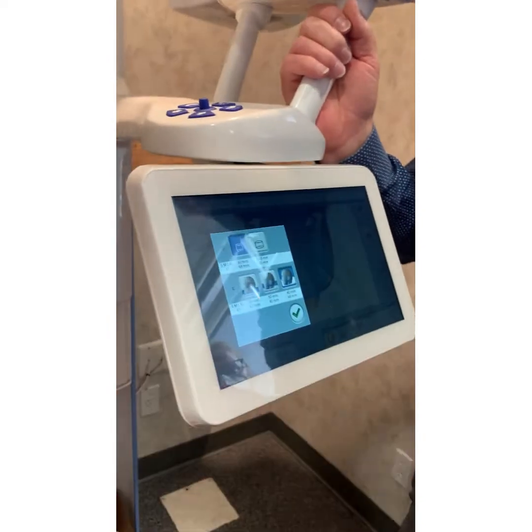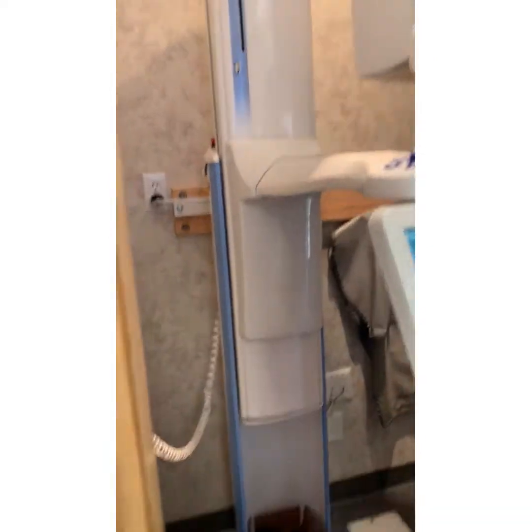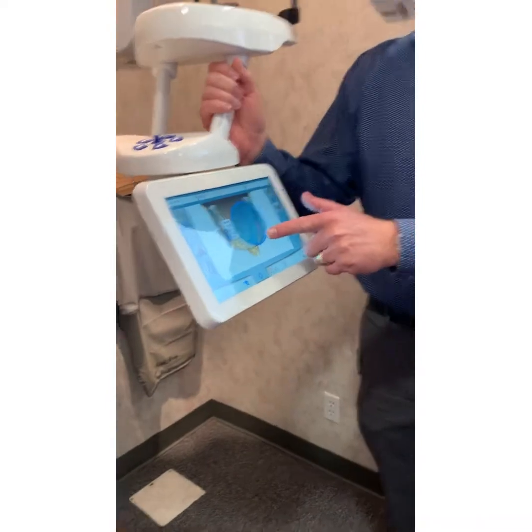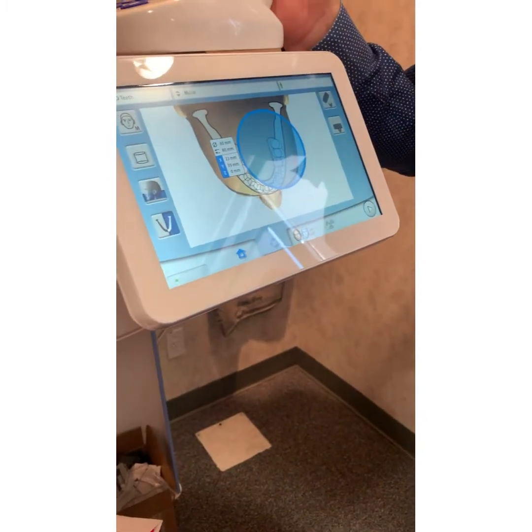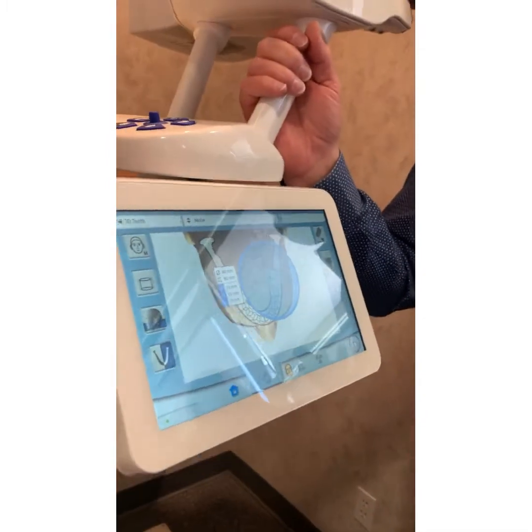I think it's easier for you guys if you do the whole thing. I'm just curious, if you do a smaller thing, the patient doesn't have to hold still as long. Yeah, even if I'm just touching 18, just to get that section, it's just faster for you, because then you don't have to wait for the computer to process it. So if we're doing 18, just tap the lower left. It doesn't take as long, the computer processes faster, and there's less radiation.